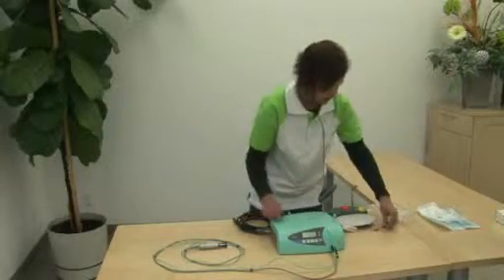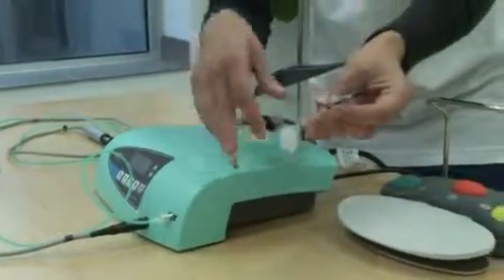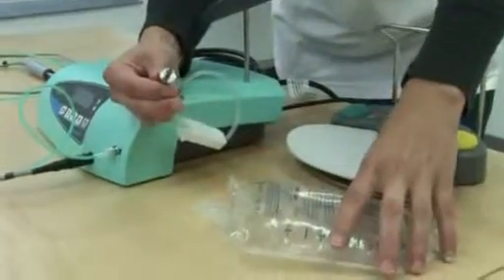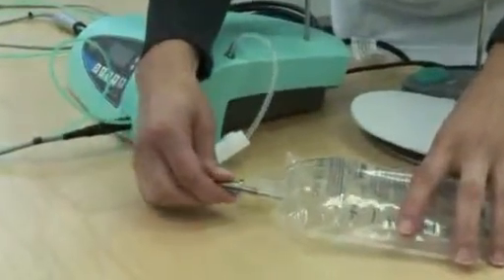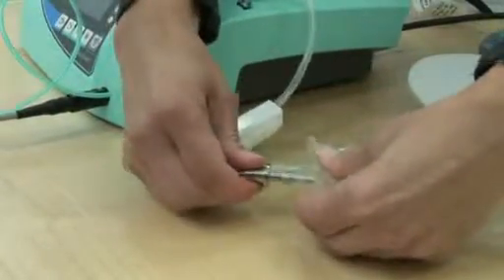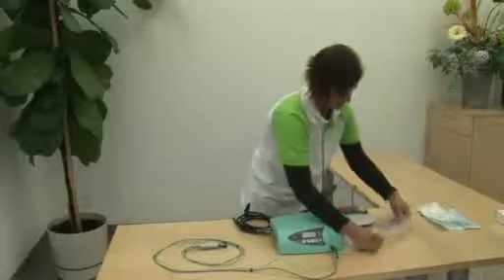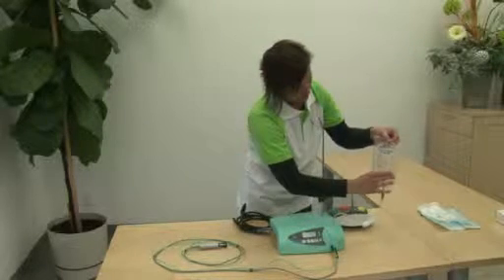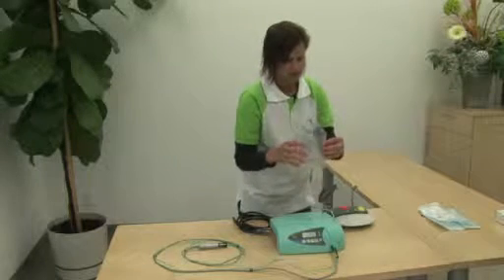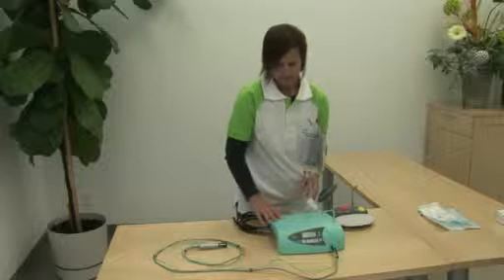Lastly, take the spike again, making sure that the roller is in the closed position. Release the protective cap. Keeping the saline bag on the table, puncture through the bag making sure it goes all the way in to the flat surface. Then make sure that you pick up the bag from the table to ensure that there's no leakage.